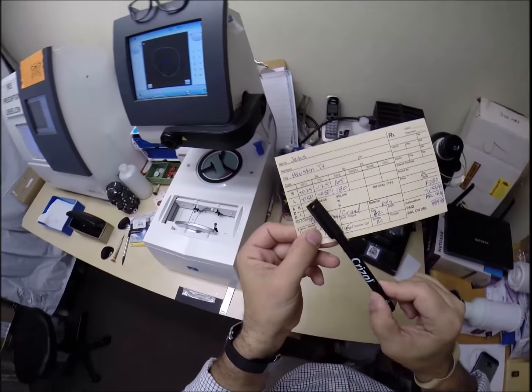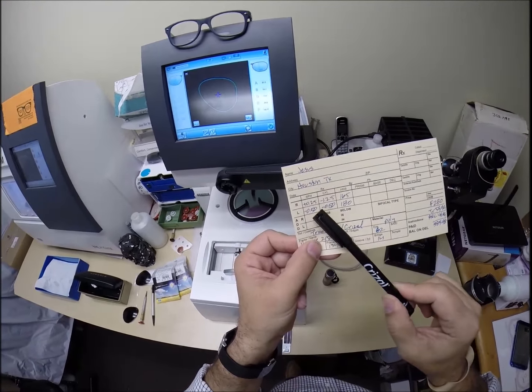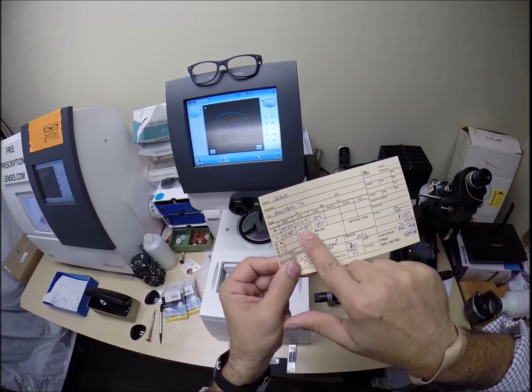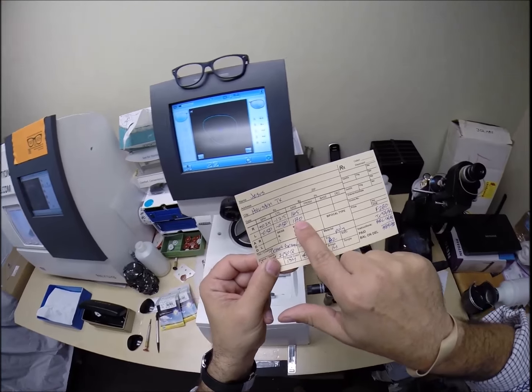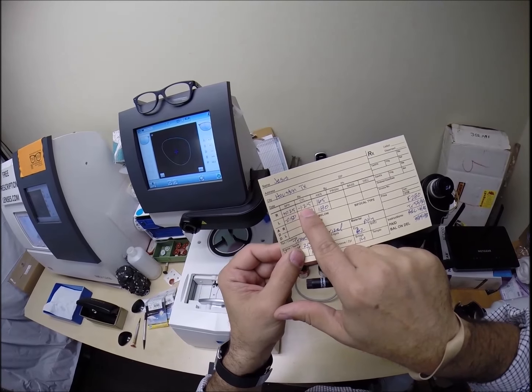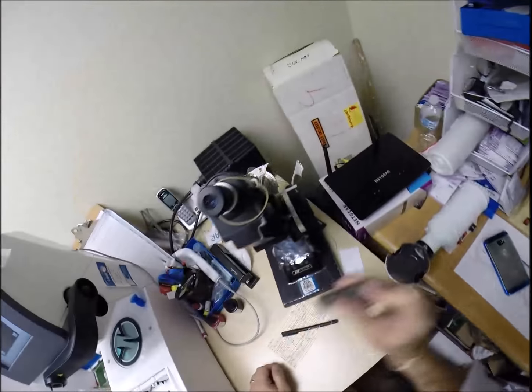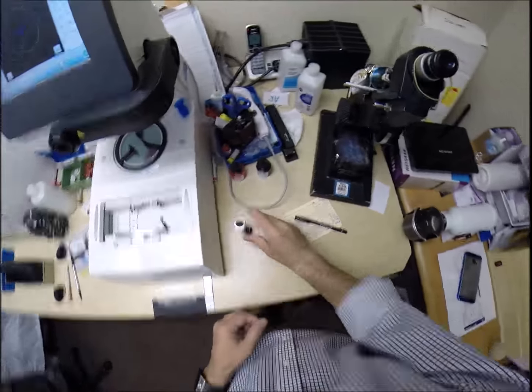Now your left eye, you need 2 steps of nearsighted correction. With your glasses off, everything is much too large in your left eye, so that's why there's a minus sign. It will minify down to the correct size, but then you only have 2 steps of astigmatism correction in your left eye, and the fine-tune knob is at 180. But let's check. Plus a quarter minus 1 1/4 will give me -1 at the very end. I'm going to check your astigmatism correction, and we're at -1, dead on. So that is perfect.